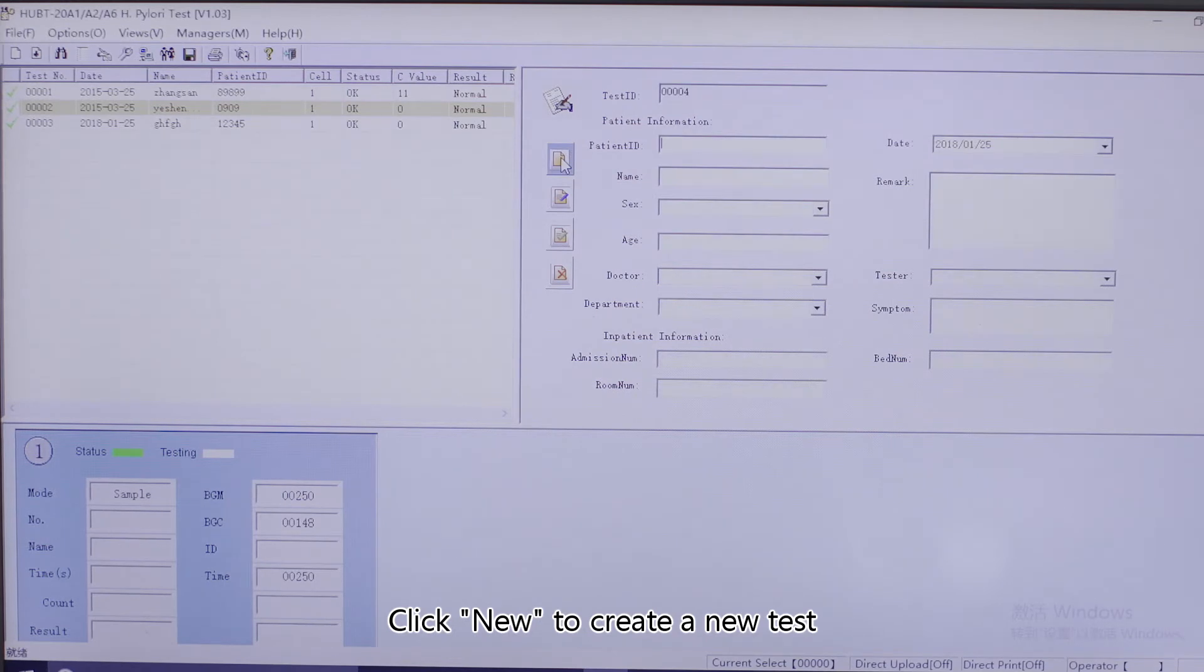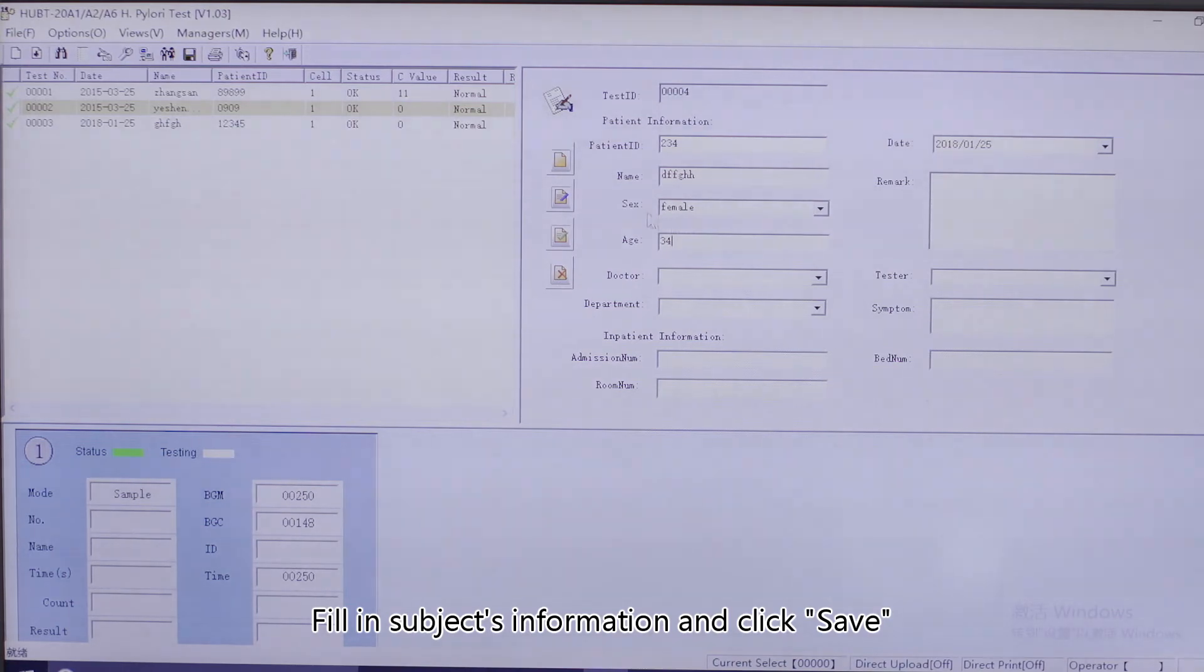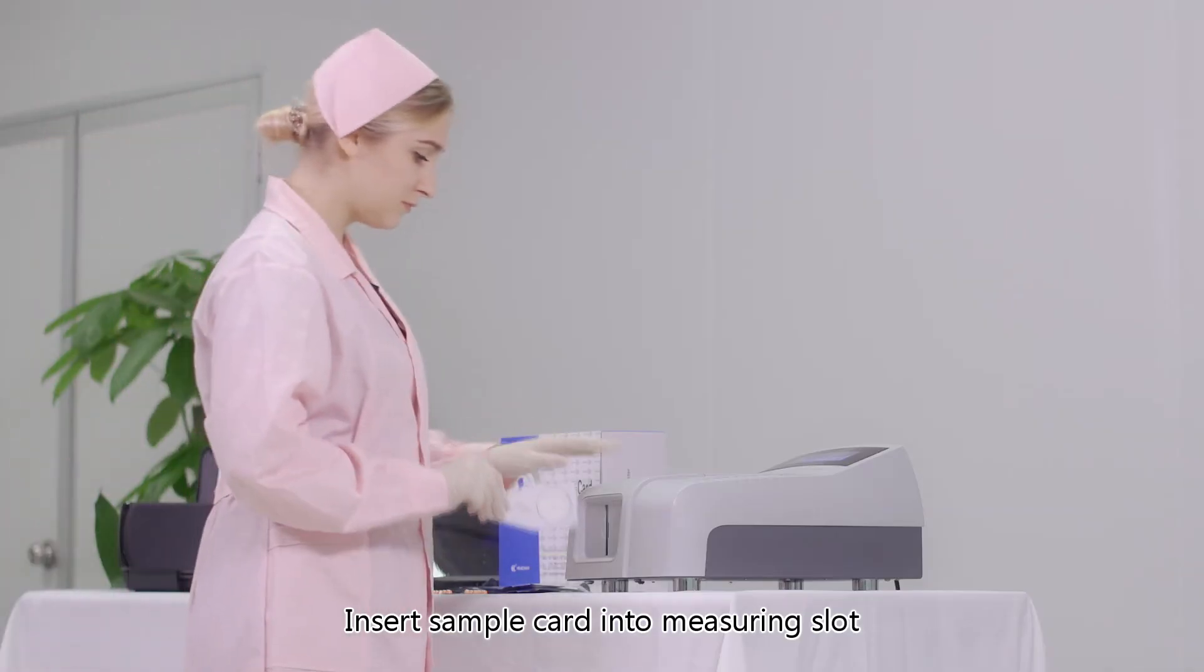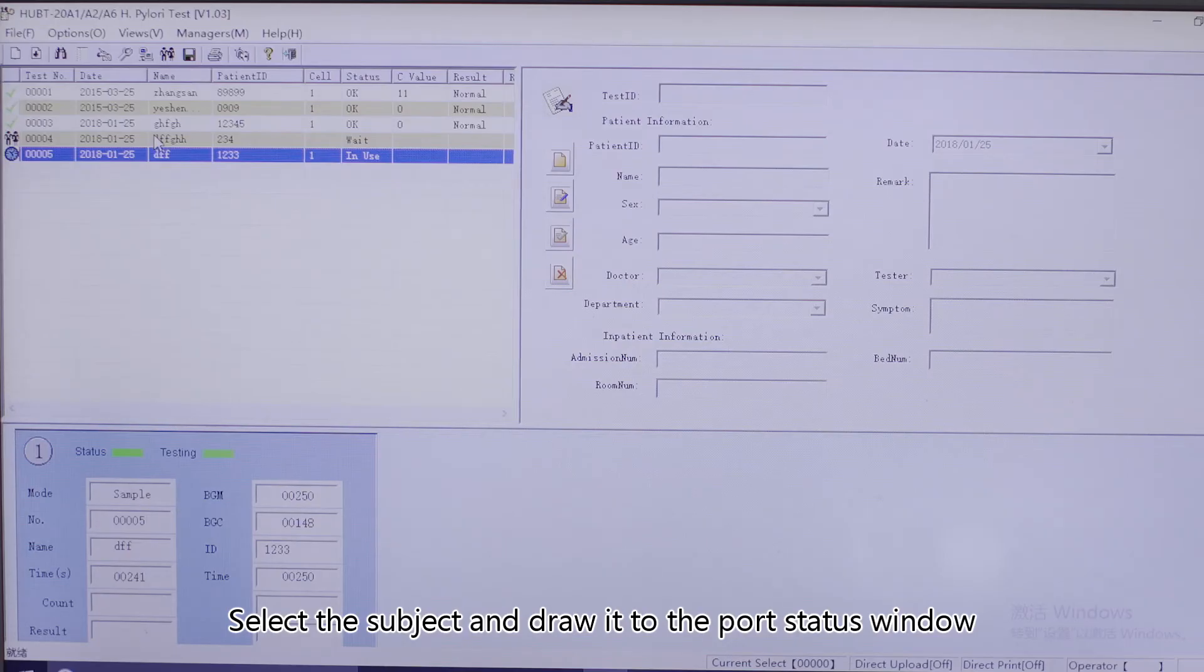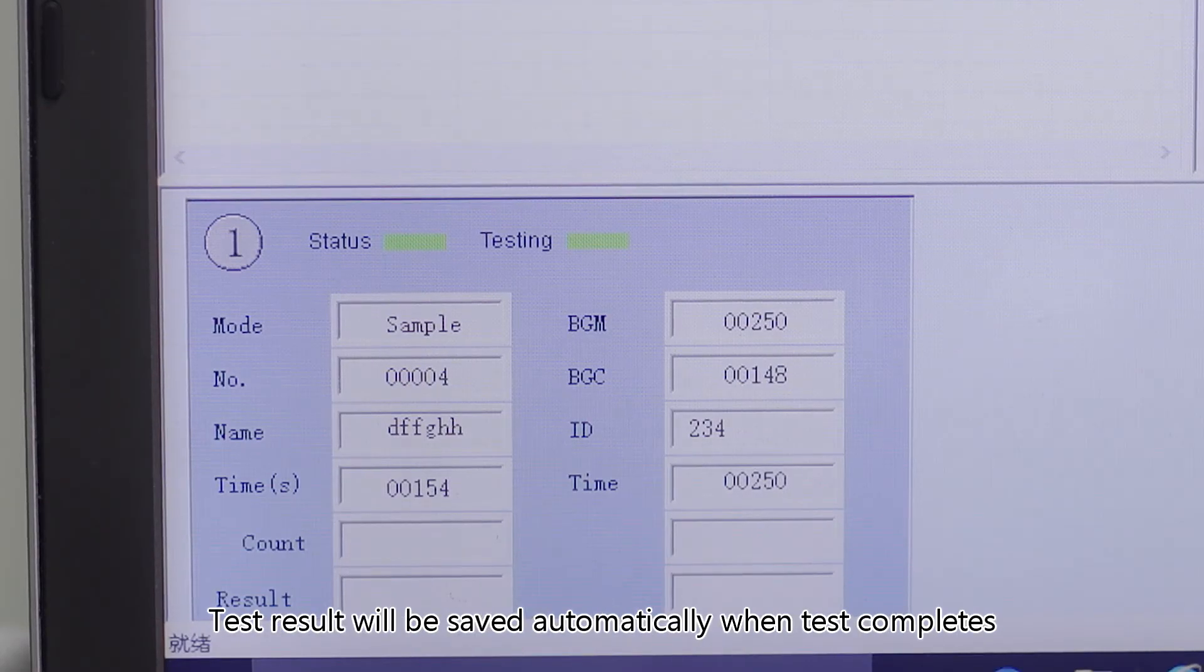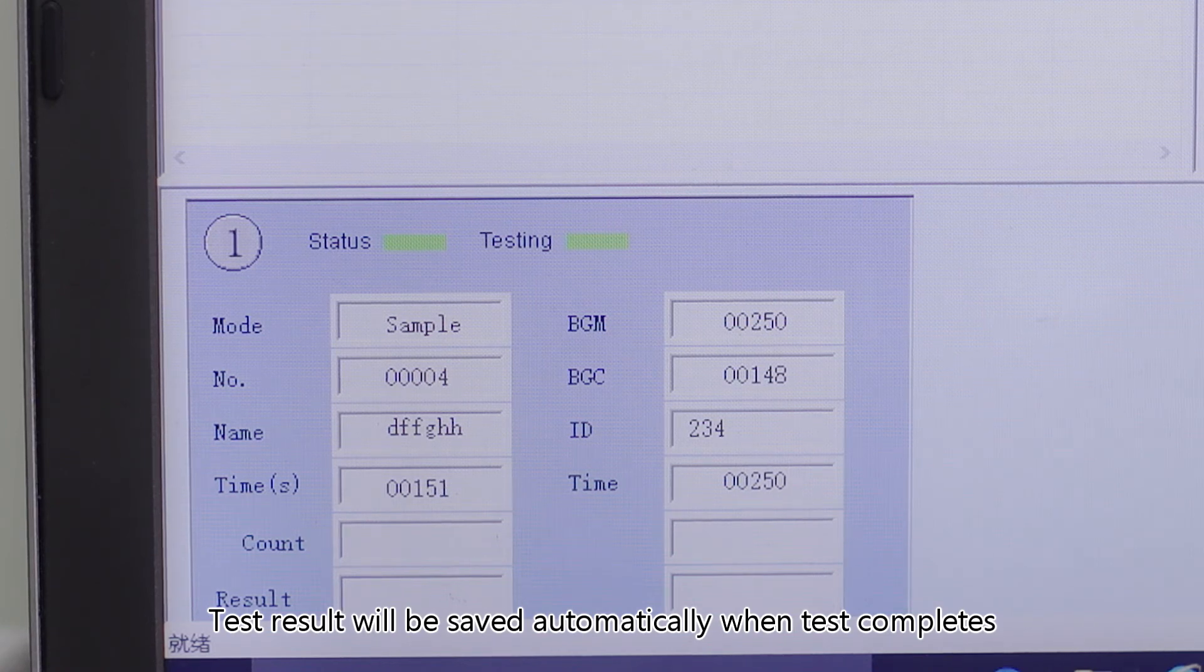Click 'New' to create a new test. Fill in the subject's information and click 'Save'. Insert the sample card into the measuring slot. Select the subject and drag it to the port status window. Test results will be saved automatically when the test completes.